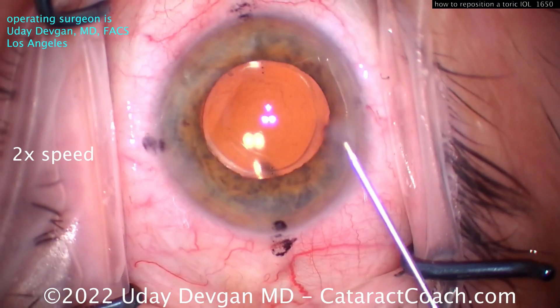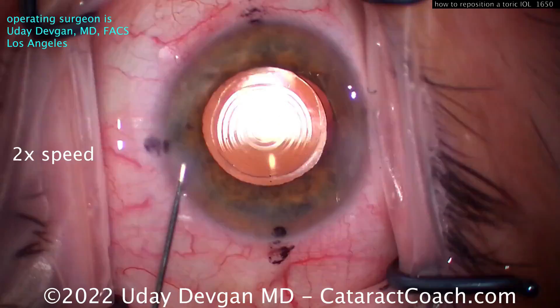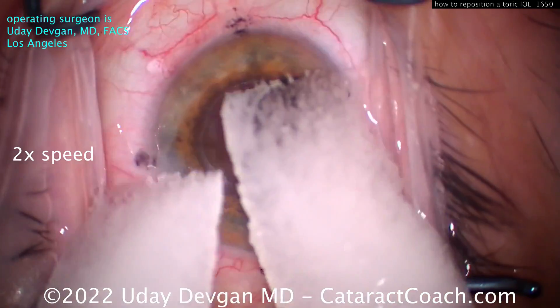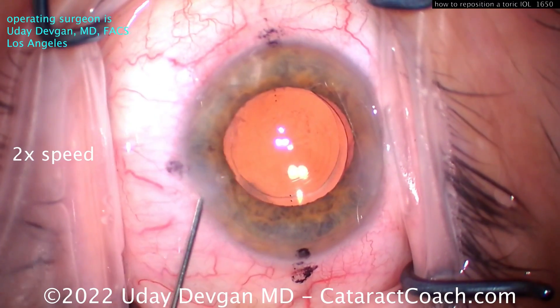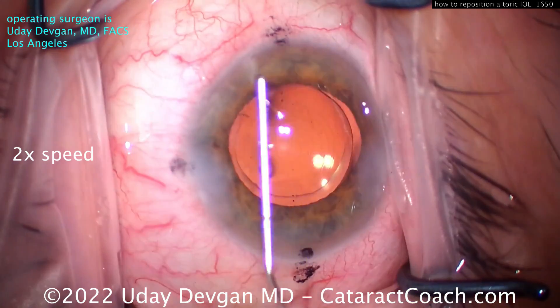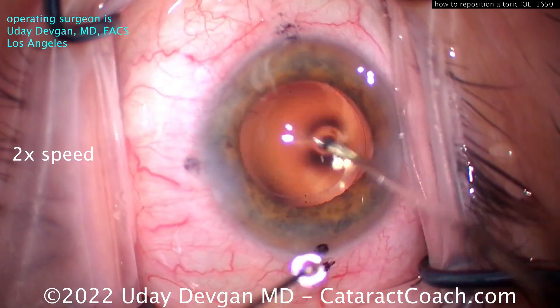At the end, we'll just seal up the incisions with a little bit of hydration — that's a great result. Do a little angle sweep to make sure you don't have any retained viscoelastic in the eye, then check the incisions to make sure everything's sealed up. The take-home message here is to be gentle on the capsular bag, don't damage it, and open up the capsular bag all the way out to the equator to free up the haptics.